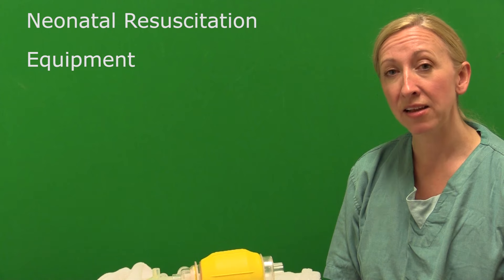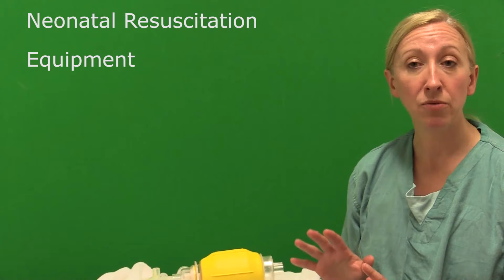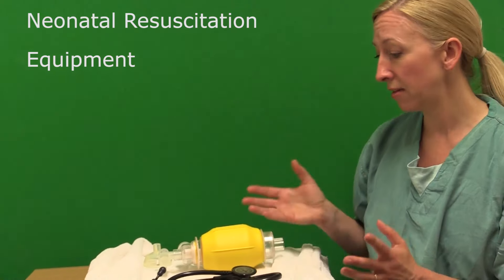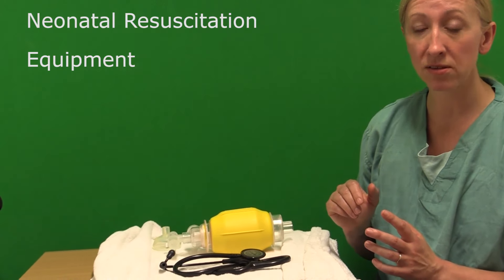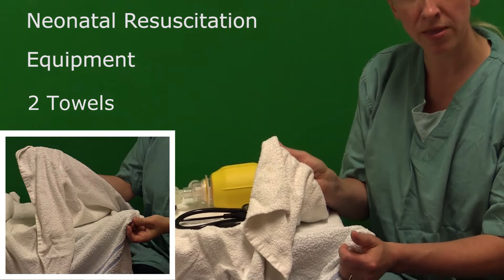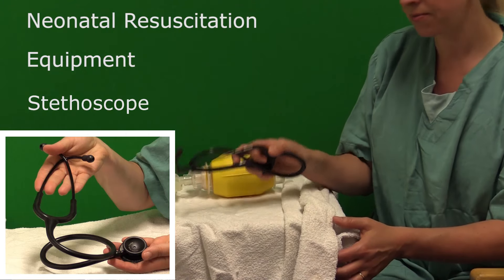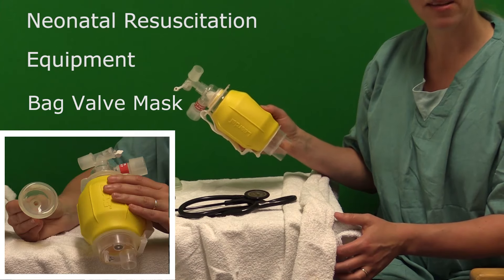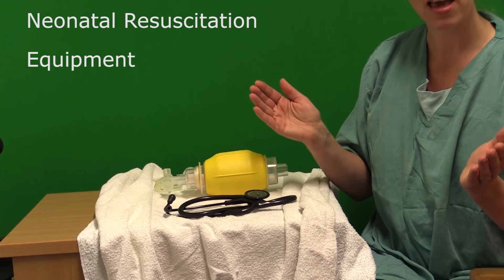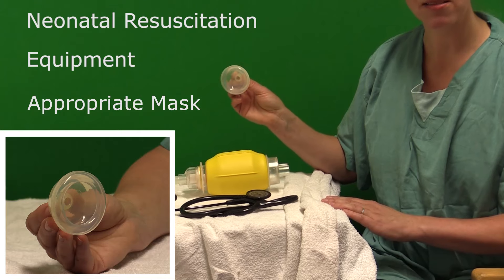One of the most important things for neonatal resuscitation is that you prepare where you can. You need to be familiar with what equipment you have in your practice area that will enable you to give support during resuscitation to the neonate. You need a minimum of two towels to dry and wrap the baby with. You need a stethoscope, as that is best practice for checking the baby's heart rate, and you need to be able to give ventilation support either with a bag valve mask or the device available in your area. It's very important to make sure that you've got appropriately sized masks.